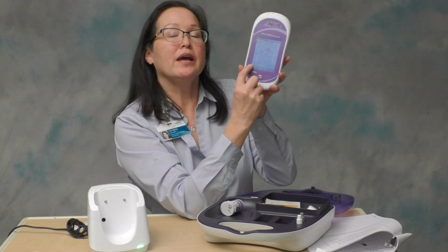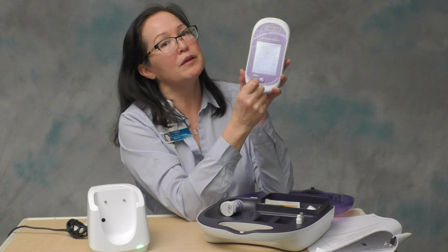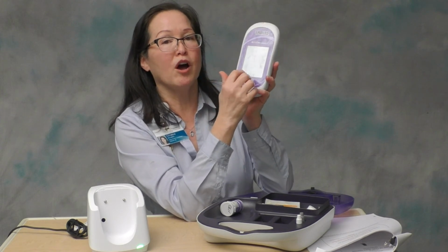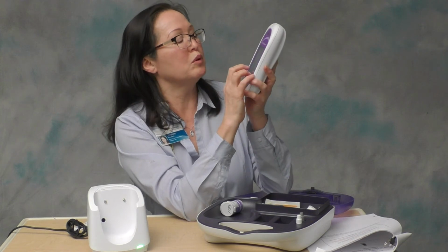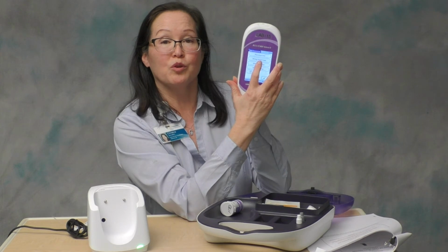And then if you see that you dosed it with the wrong bottle, there's a little comment bubble button down here in the lower left-hand corner. You can tap that comment button and a list of comments will pop up, and one of the comments is that you used the wrong QC bottle. It says wrong control used.